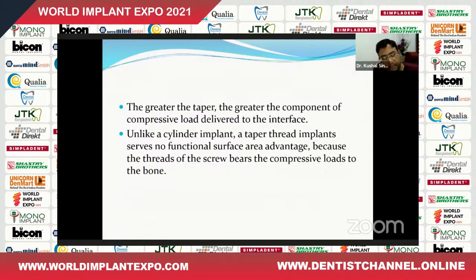The greater the taper, the greater the component of the compressive load delivered to the interface. Unlike in cylindrical implants, the tapered threaded implant serves no functional surface area advantage, because the threads of the screw bear the compressive loads to the bone.